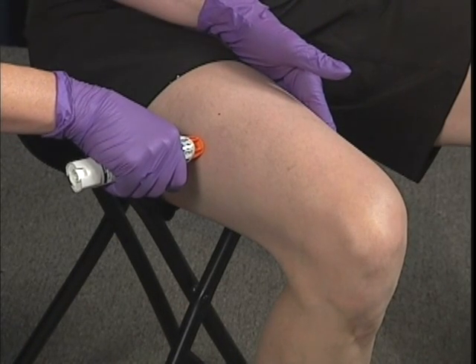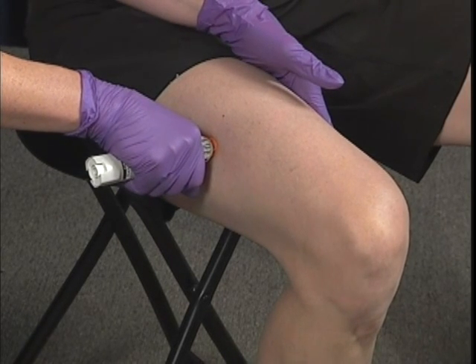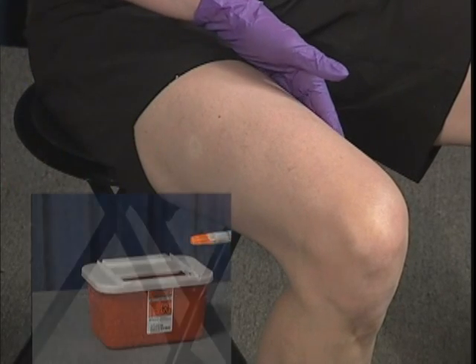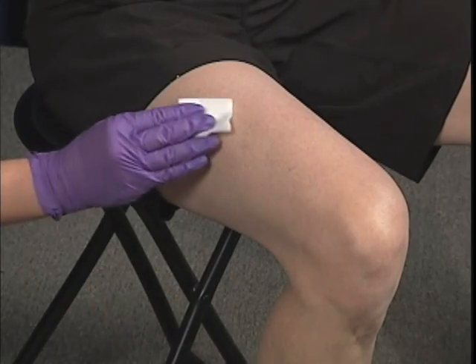Stabilize the patient's leg to prevent them from pulling away and apply gentle pressure against the leg with the auto-injector until it clicks. Hold in place for 10 seconds before removing the auto-injector in order that all the medication can be delivered. Properly dispose of the auto-injector in an appropriate sharps container and apply a bandage over the injection site.